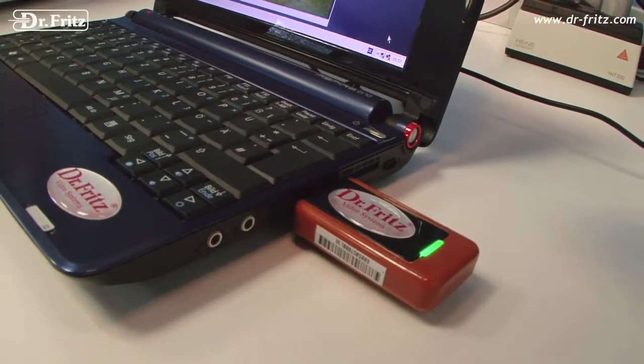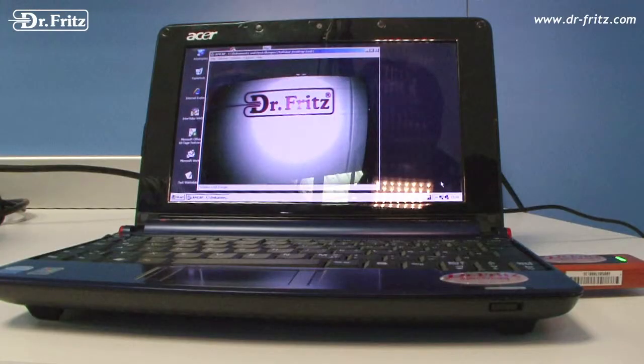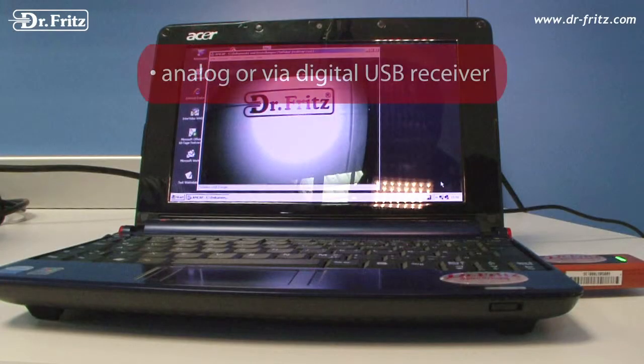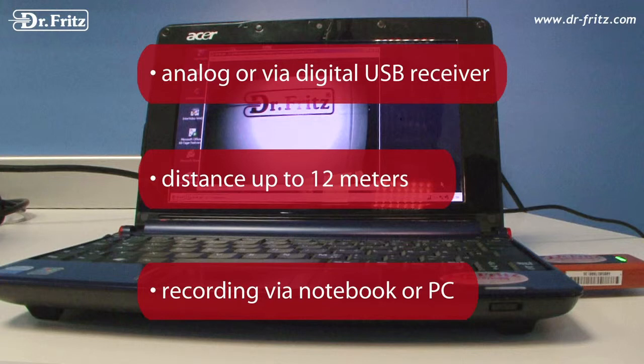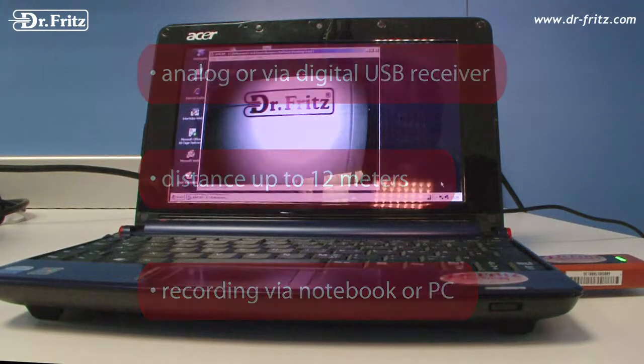The wireless video transmission is a completely new feature in gastroscopes. The signal can be received via analog or digital USB receiver from a distance up to 12 meters. Whether notebook or conventional PC, the wireless transmission is incredibly easy to display and record.